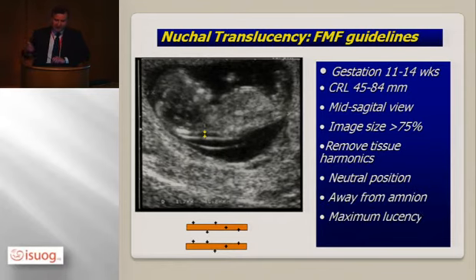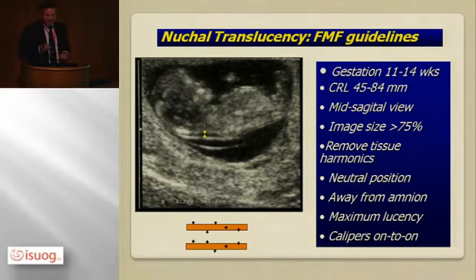So let's get going. This isn't the wrong slide in the wrong lecture, although you may think, what on earth is this man talking to us about nuchal translucency and Fetal Medicine Foundation accreditation? Well, the FMF realized at a very early stage that if you were going to measure a nuchal and base a risk assessment on it, and I apologize for this nuchal, this is a very early picture from the start of the FMF accreditation process, you needed to standardize your measurements.